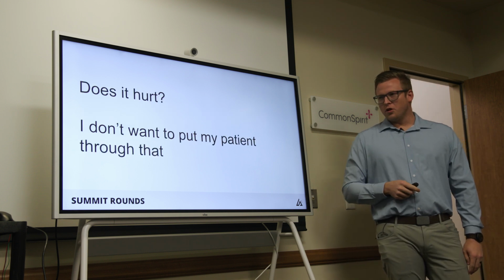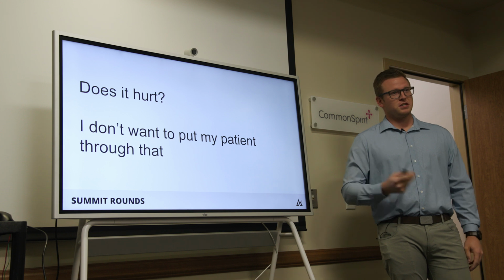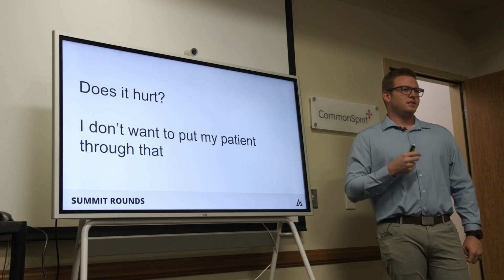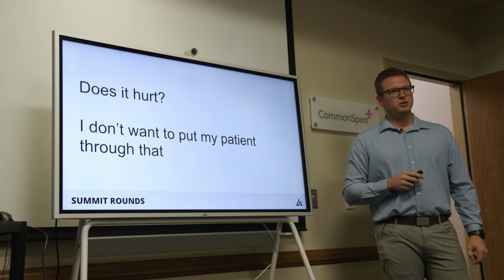This is the big one we get a lot. Does it hurt, right? Do I want to send my patient for a diagnostic test that's very uncomfortable? Is that worth the value that we get and the information from the EMG report?